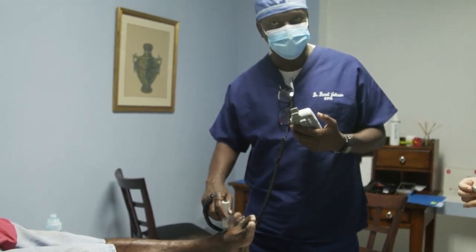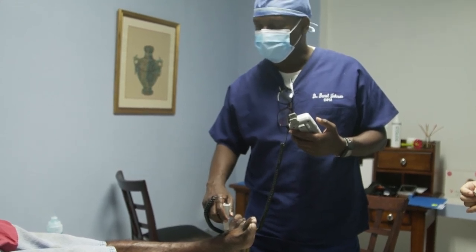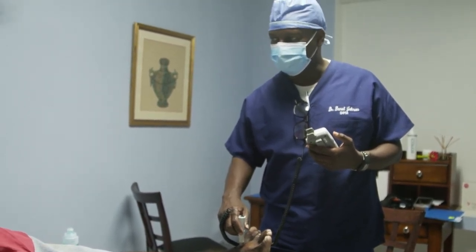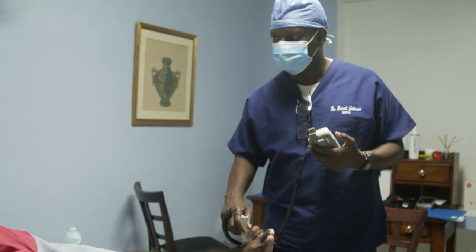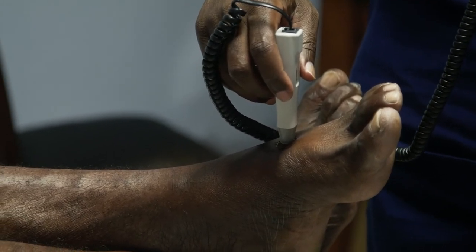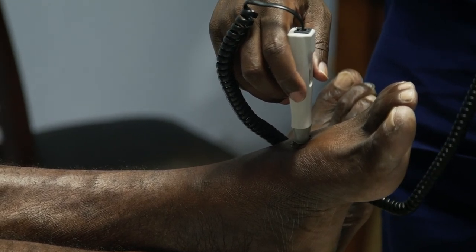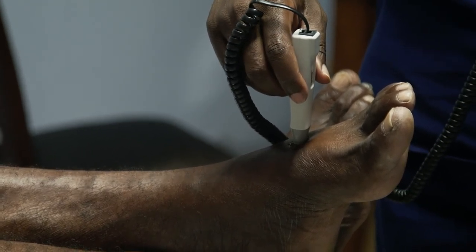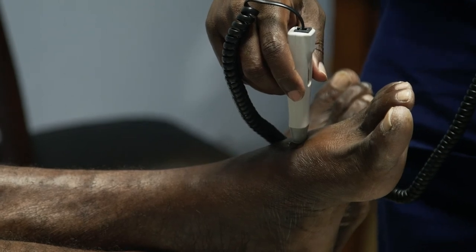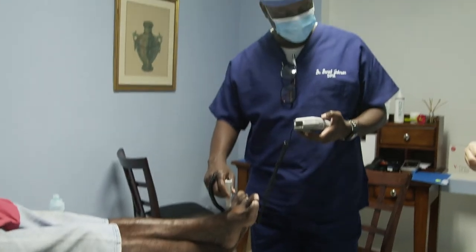Cameraman, can you hear that sound? So this is a Doppler ultrasound. It's like when they look for the babies and you can hear the baby's heartbeat. I'm looking for the blood vessel that comes down and supplies your toes and the top of your foot, because the skin on top is more difficult than the skin on the bottom. So this is the dorsalis pedis. We can hear it nice and clearly. It makes me very happy. Nice sound.